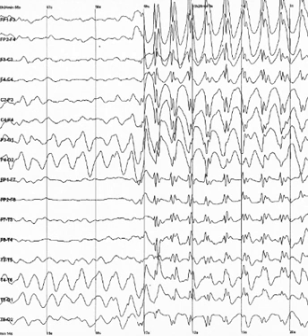Referential montage. Each channel represents the difference between a certain electrode and a designated reference electrode. There is no standard position for this reference; it is, however, at a different position than the recording electrodes. Midline positions are often used because they do not amplify the signal in one hemisphere versus the other, such as Cz, Oz, Pz etc. as online reference.